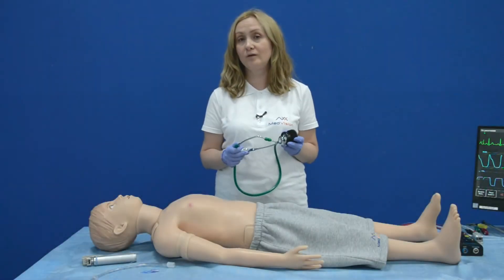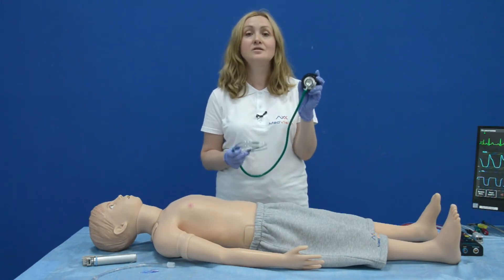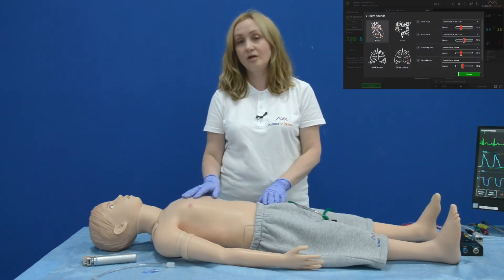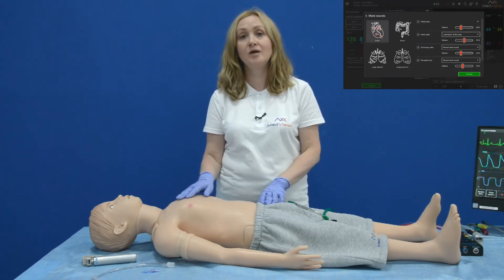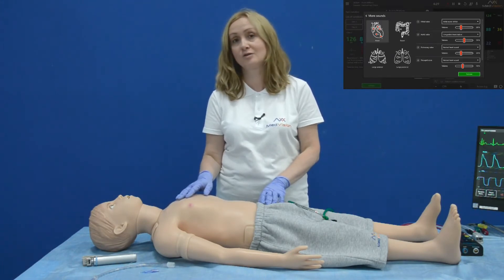With Arthur, you can develop auscultation skills. For these purposes, we use the smart scope together with a real stethoscope. Arthur provides five heart auscultation points, four bowel auscultation points, five anterior lung auscultation points, and six posterior lung auscultation points.